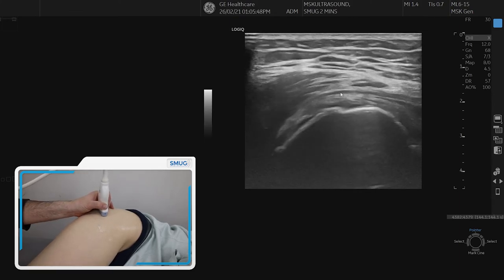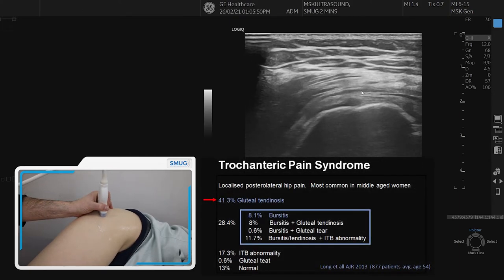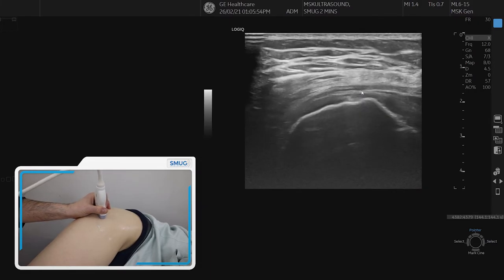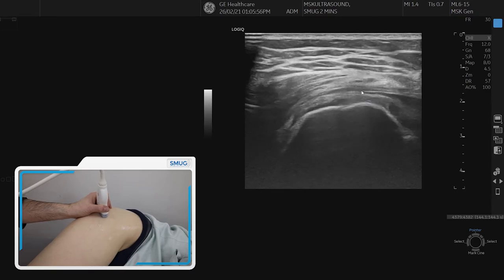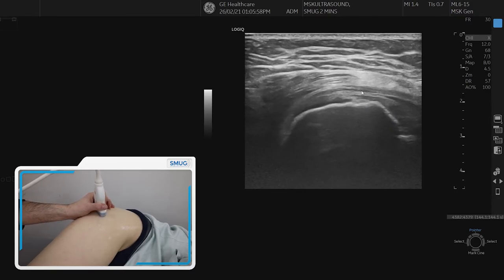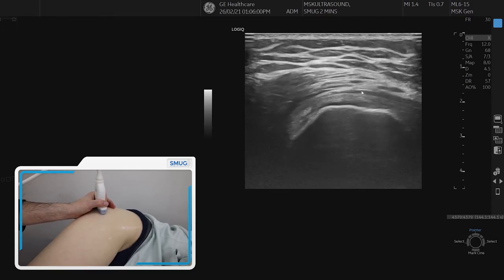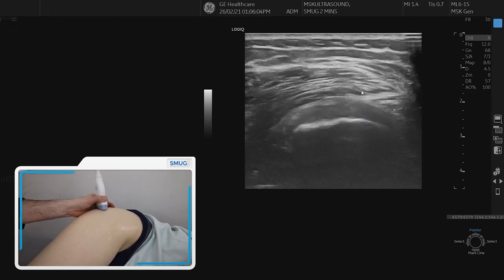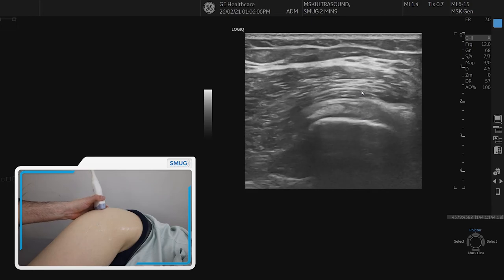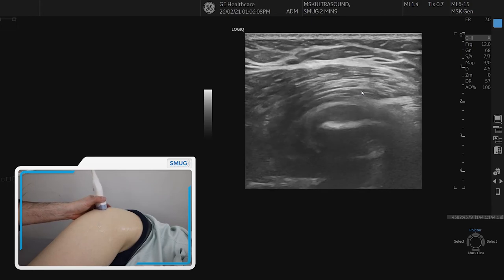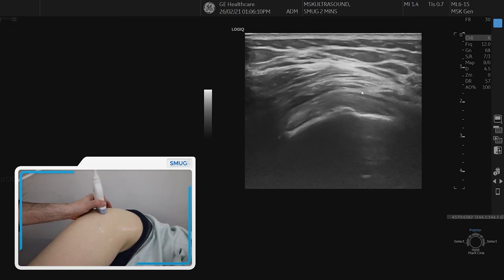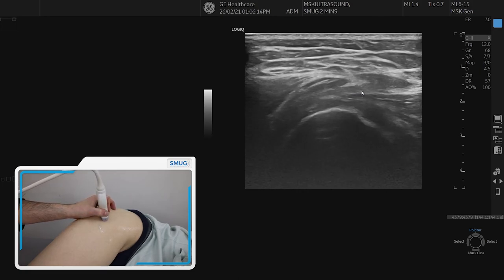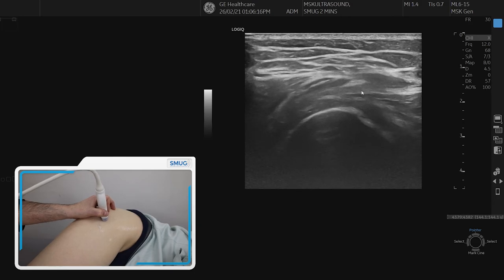Also bear in mind that bursitis on the lateral hip is not as common as is often thought. You can often see tendinopathies or other changes, but purely a bursitis on its own is not common — it's just not as often found. And that's it. That's how you assess the superficial layer going over the deep layer on the lateral hip, looking for bursitis, swelling, or any tendinopathy occurring in that area.